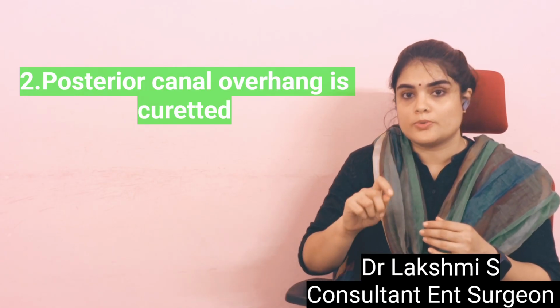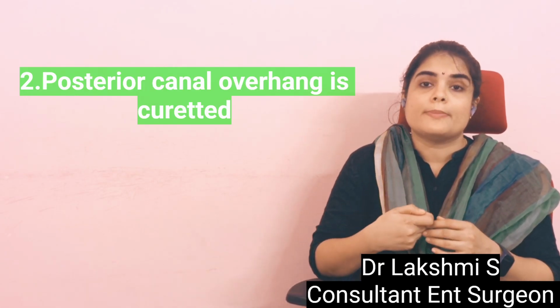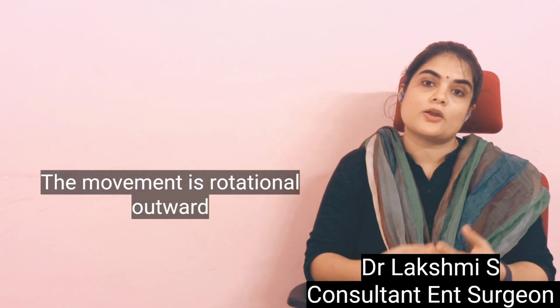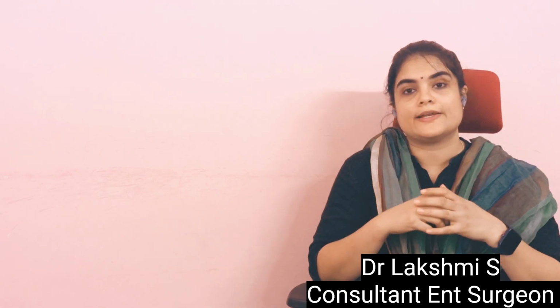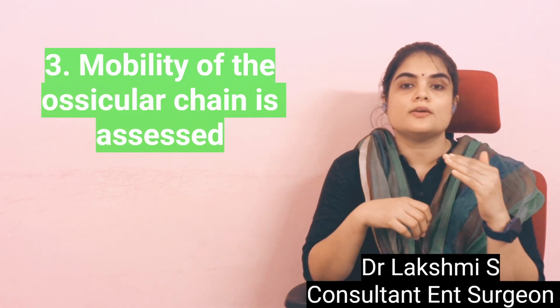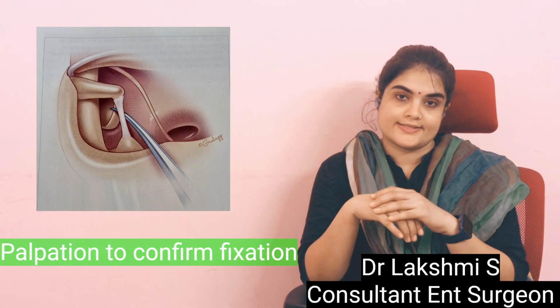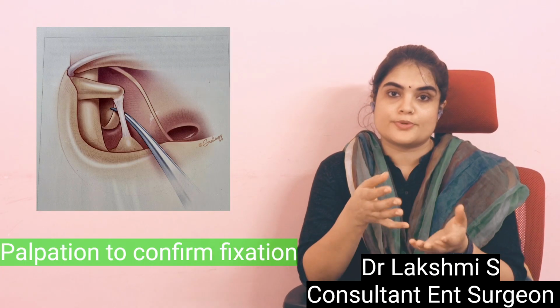When you are curetting, the movement should always be outward, because a sudden inward movement can cause injury to the incus, and also the chorda tympani nerve should not be injured while you do this. Then the mobility of the ossicular chain is checked. So malleus, incus and stapes mobility is checked, and if the stapes is fixed, you can proceed with the surgery.